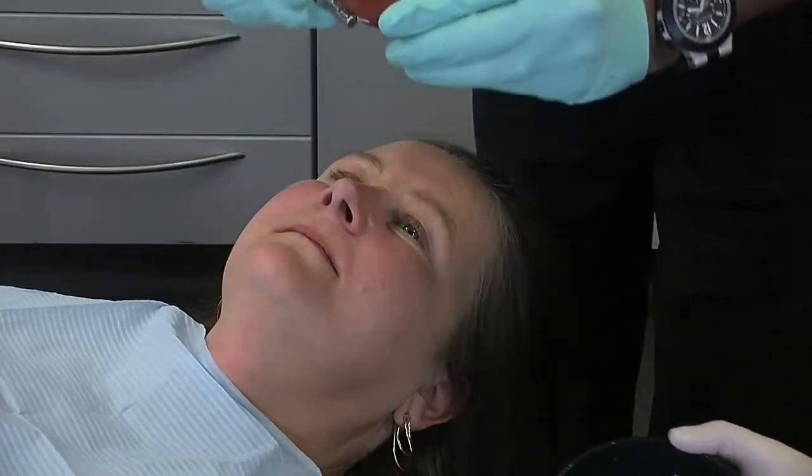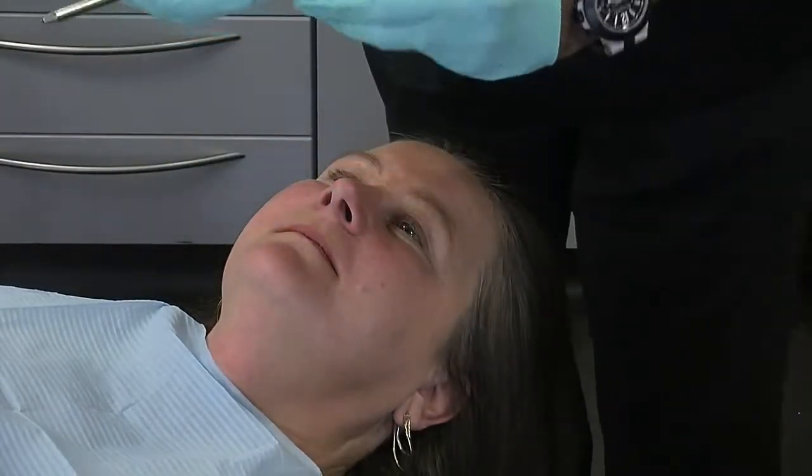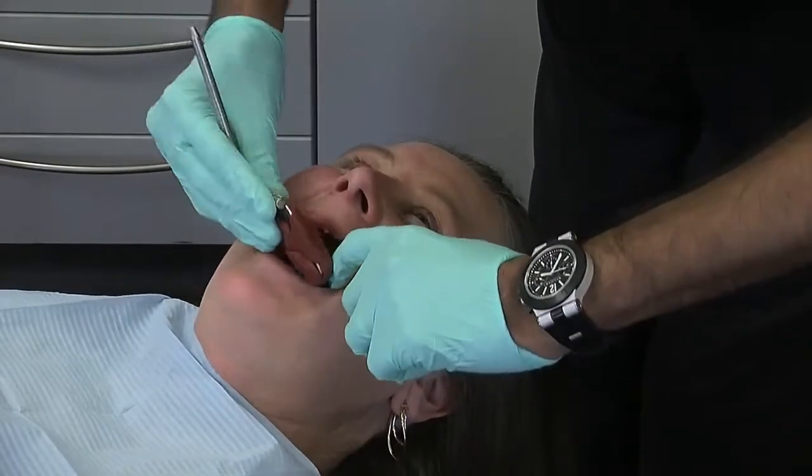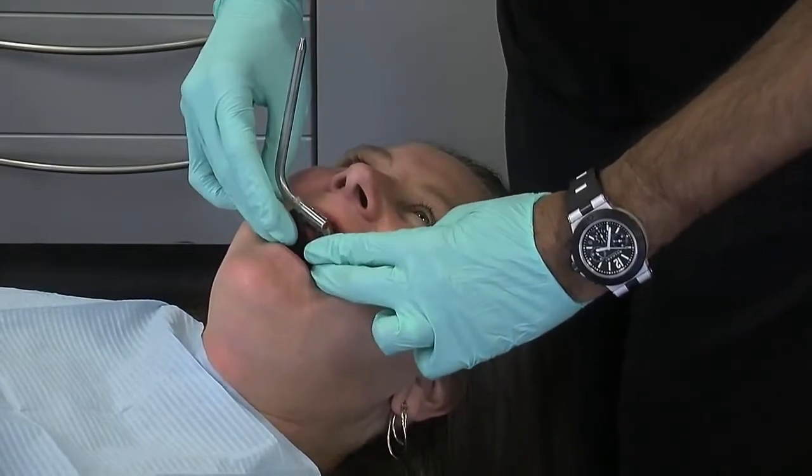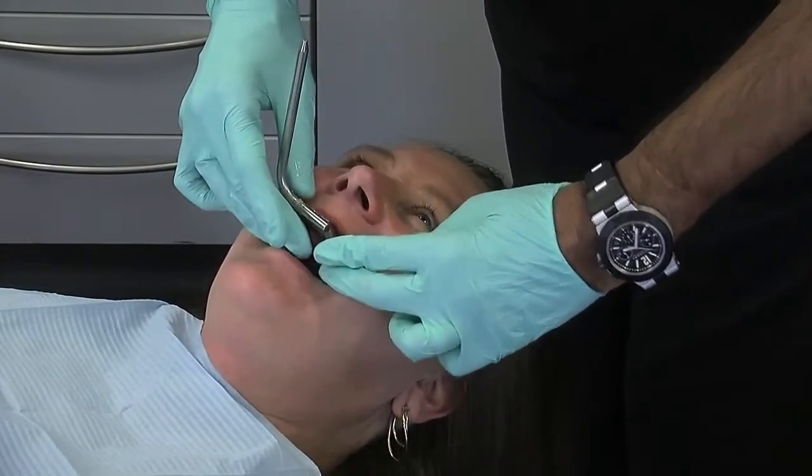This goes to the patient's right. Dina, just look up and open for me, keep your eyes open — that's beautiful. I'm going to come here. This line has to be right in the middle of the face, which it is, and I get this bite horizontal parallel to the interpupillary line. I'll come around the front and just check. That looks perfect.